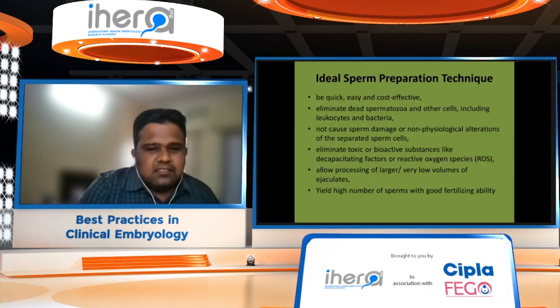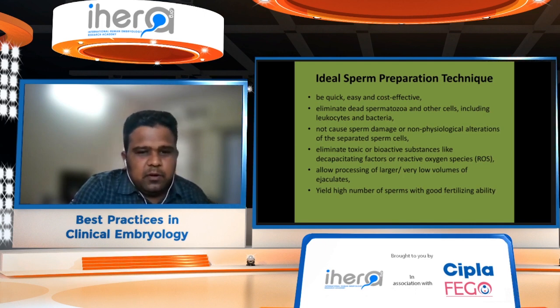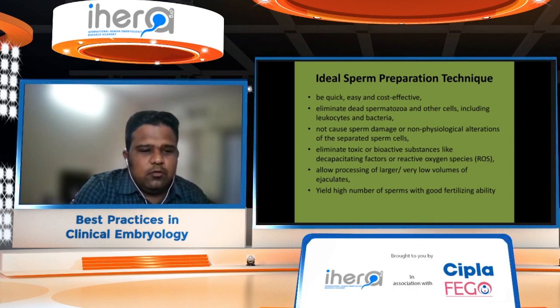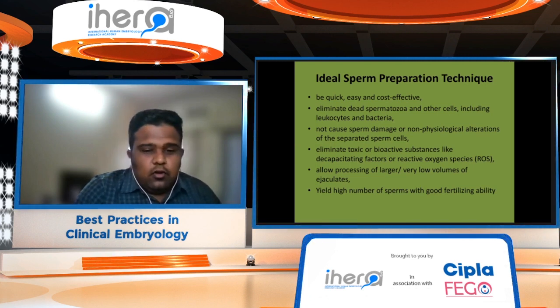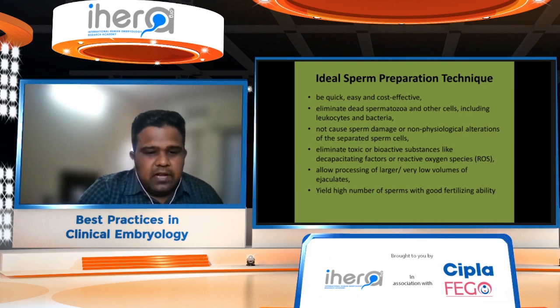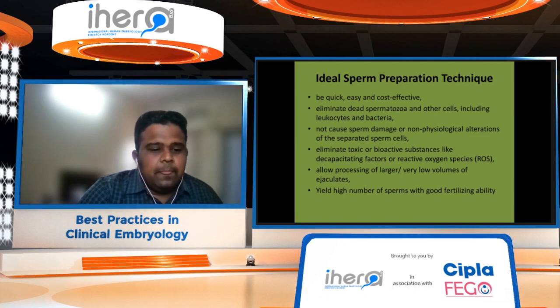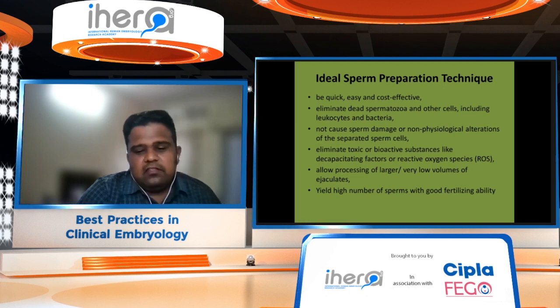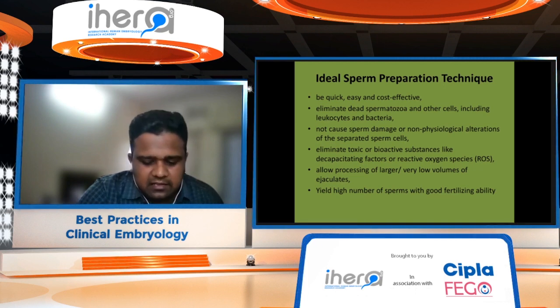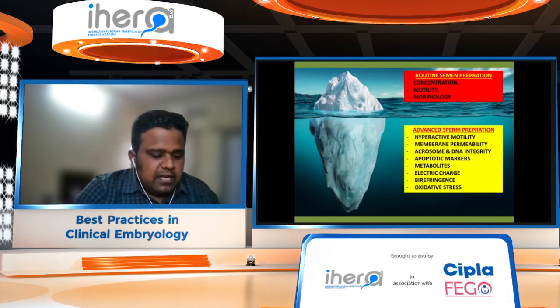As my friend has rightly mentioned in his presentation, the ideal sperm preparation technique must be quick, easy, and cost effective, eliminate dead spermatozoa and other cells, not cause any kind of sperm damage or non-physiological alterations to the separated sperm, and yield a good number of spermatozoa with good fertilizing ability. That is the main point that has to be added in the ideal preparation technique.